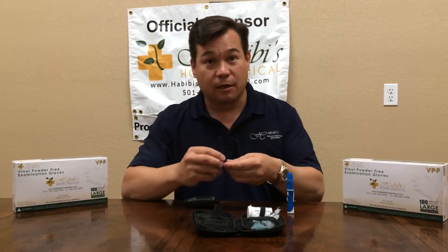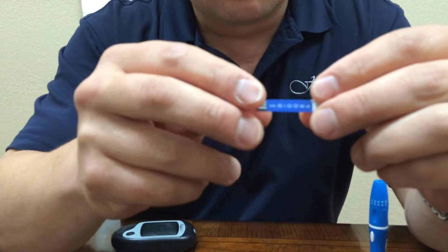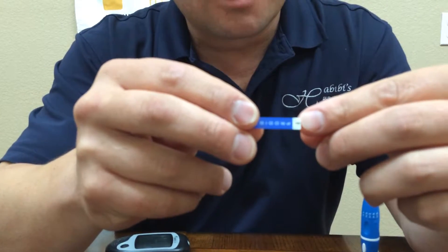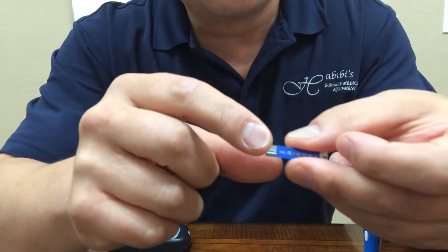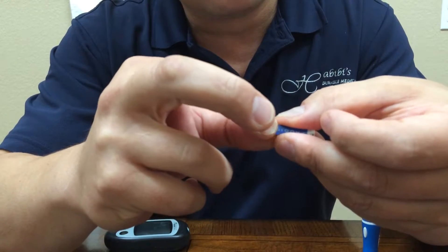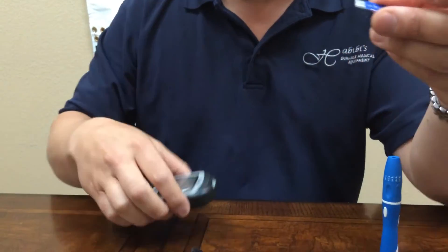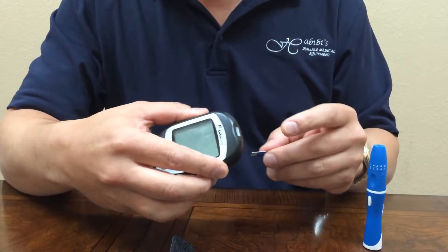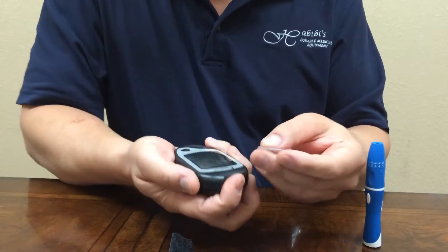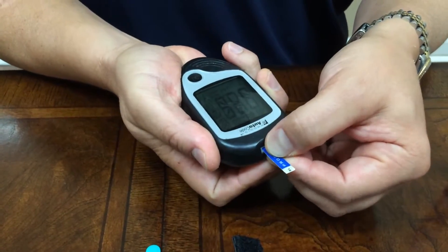Once the lancet injector is loaded, we will then load the strip into the meter. Now, on the strip, there are two ends — the end that takes the blood with the little side that's portioned off, and the side that you plug into the meter. There's a small ridge that is very tactilely indicative of where it goes into the meter. This is set up very nicely with a nice little ridge here where the strip will go into the meter. If you grab this and put your finger right there next to the hole, it makes it quite easy to put that in there.